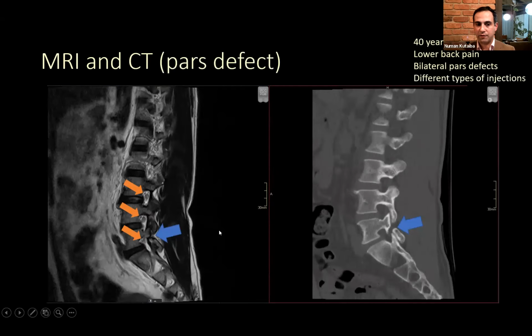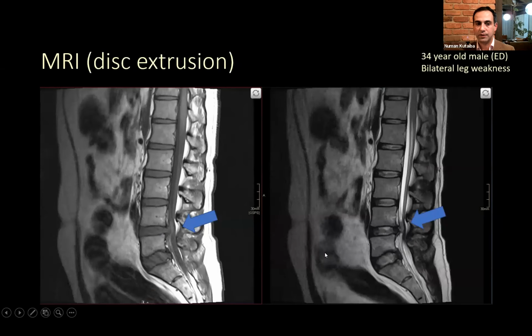This patient here, for example, has a pars defect, similar to the one we showed with the x-rays. It's a young patient, has tried multiple injections of different nerve roots and facets, and the pars defect itself. The nerve root itself is not compressed. Most of the pain is probably mechanical, and it's arising from this. This is a stress injury that happened a while ago. So it's a fracture that keeps giving them pain. They may end up requiring surgery to fix this level so it doesn't cause any symptoms with movement.